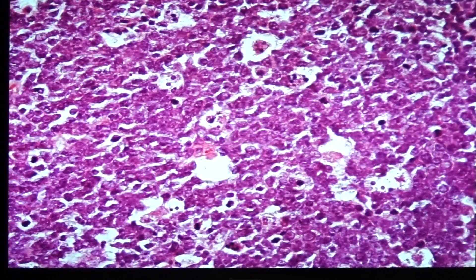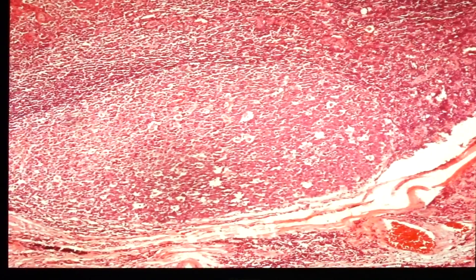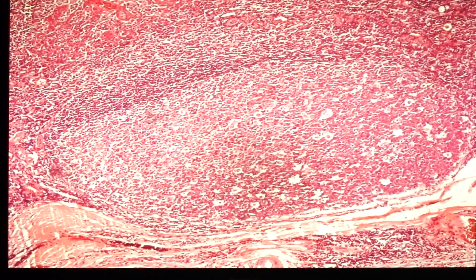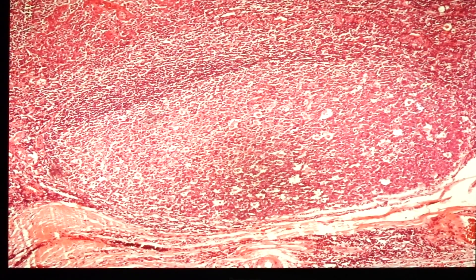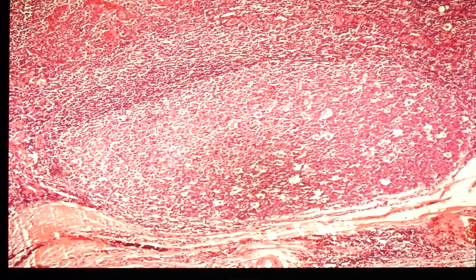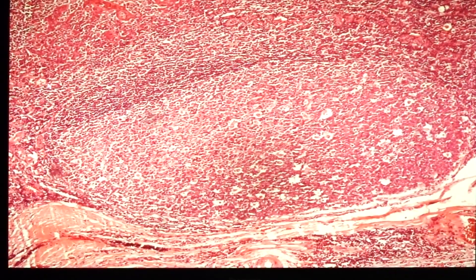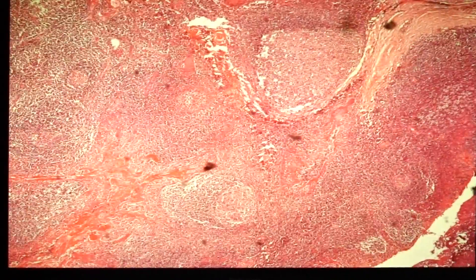If you look at this particular follicle, you would notice a darker area and a lighter area. These are what we call the dark and light zones of the germinal center. The dark zone refers to the presence of centroblasts, and the lighter zone refers to the centrocytes. So if you have the presence of dark and light zones, tingible body macrophages within the germinal center, and a surrounding mantle zone, then think of a benign condition — this is reactive hyperplasia of the tonsil.